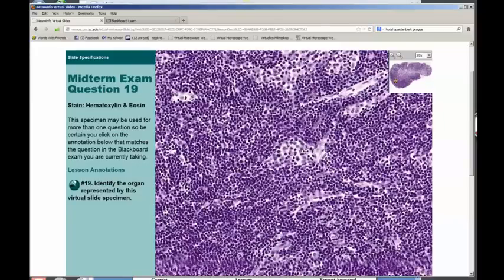That is, if you look here, these are the endothelial cell nuclei, and they're not thin and flat. They're rounded. And if you move around, you can pretty much make out the endothelial lining. And there are lymphocytes, and there's probably a plasma cell with an eccentric nucleus, and some other lymphocytes here in the lumen. And this is the place where the T lymphocytes that have been circulating in the body come out here and go into this deep cortex. So now we're going to go to the next question, which is question 20.